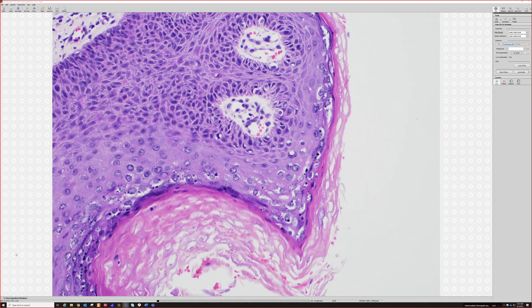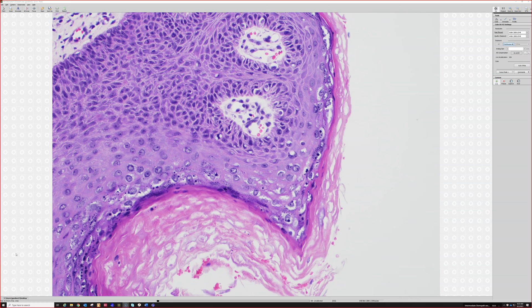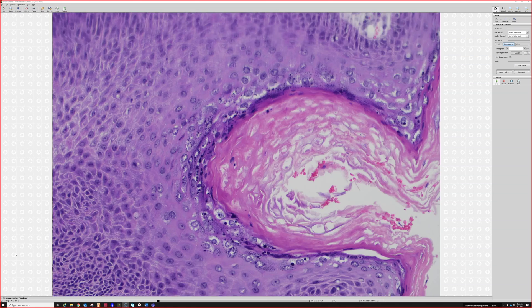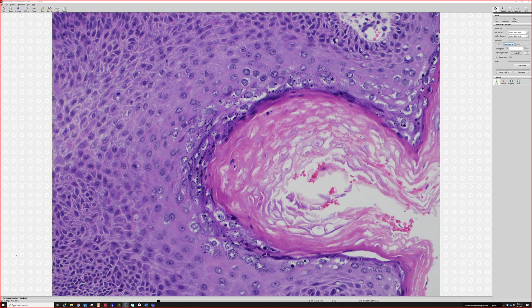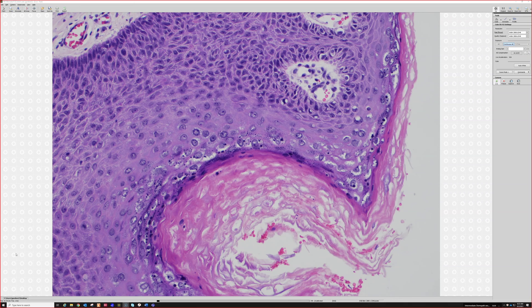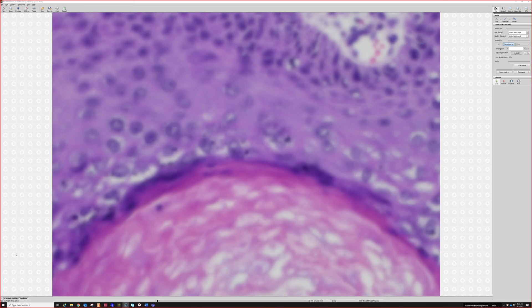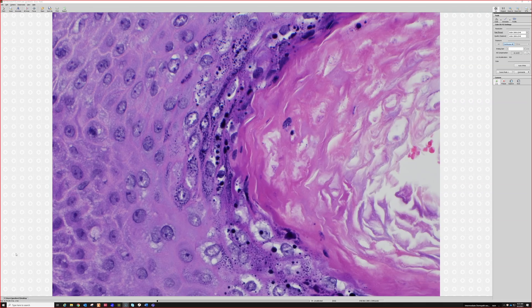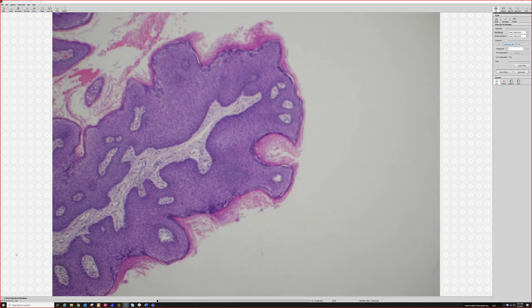If I have a lesion I'm suspicious about but not certain, I'll do HPV in situ hybridization. A positive result is really helpful to support condyloma; a negative does not totally exclude it, because the probe I currently use covers HPV types 6 and 11 — a low-risk mixture — and there are many HPV types. Not every in situ hybridization will have probes for all types that could possibly cause genital warts.